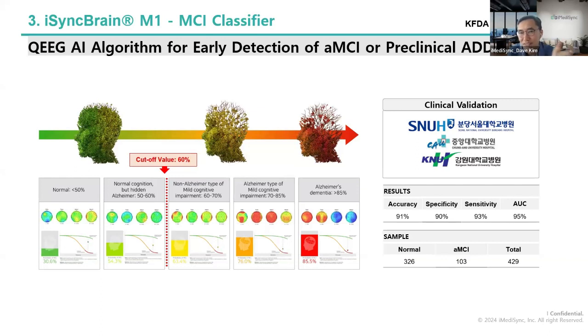So there can be a difference in terms of clinical accuracy, and also the denoising is very important. Making clean data is always important.